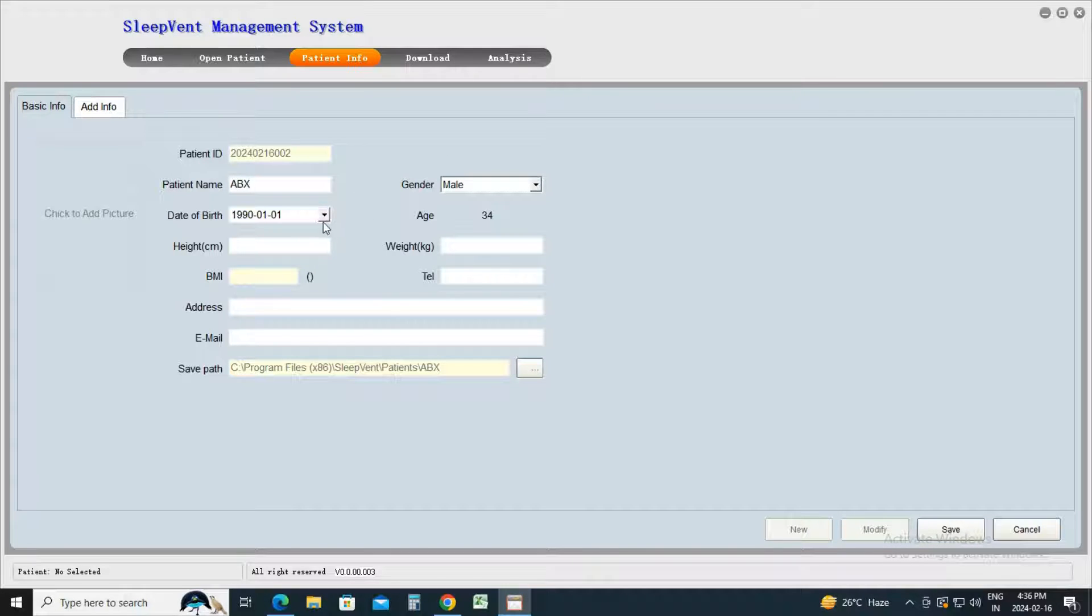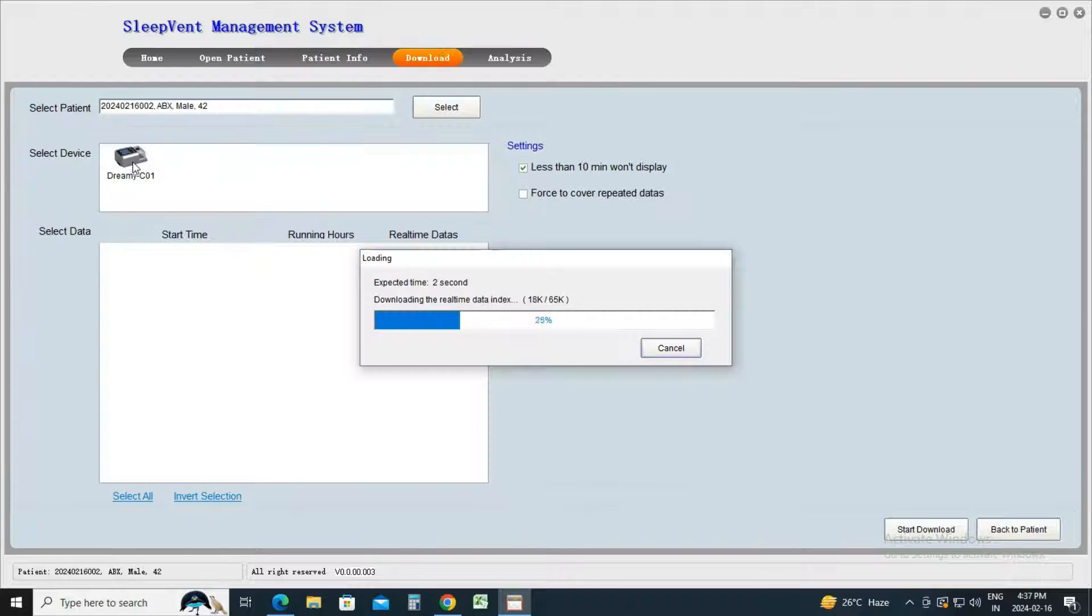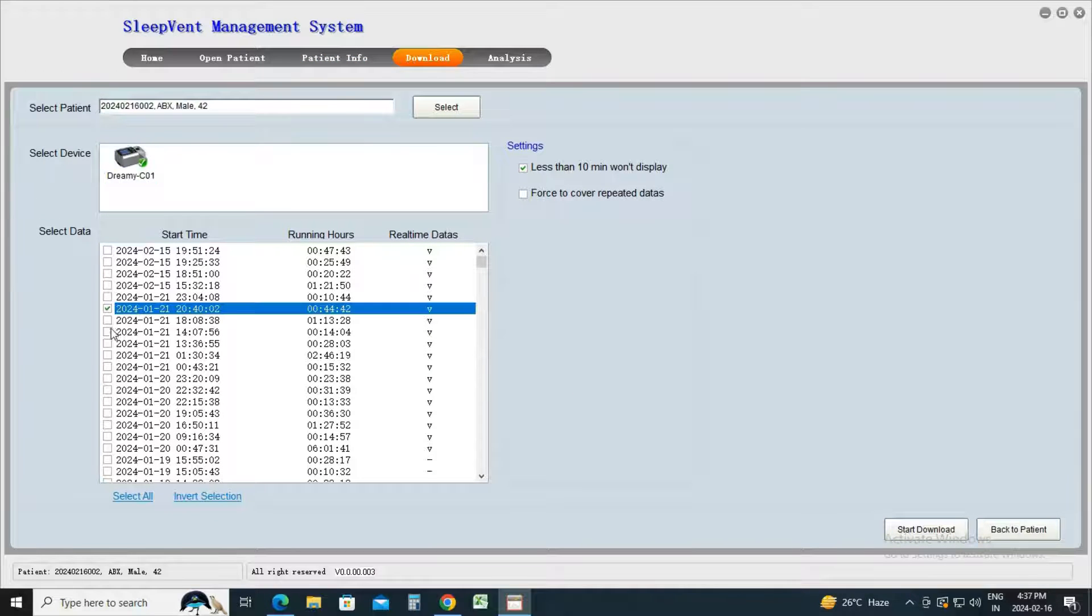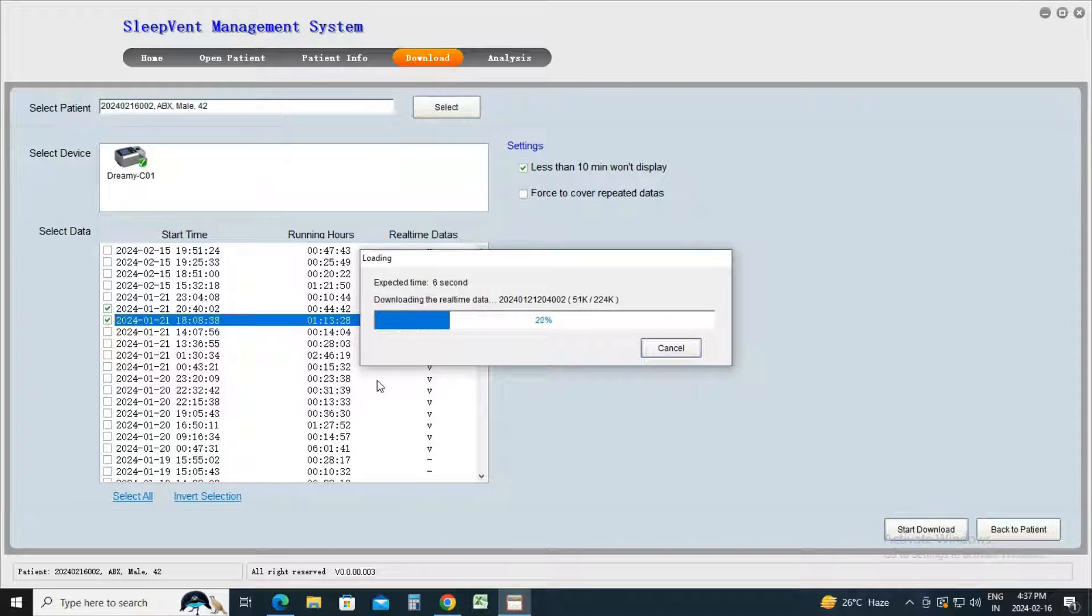After adding patient information, proceed to the Download tab. Select the date for which you want to download the report. Choose the device and the desired date, then click on Download Data.